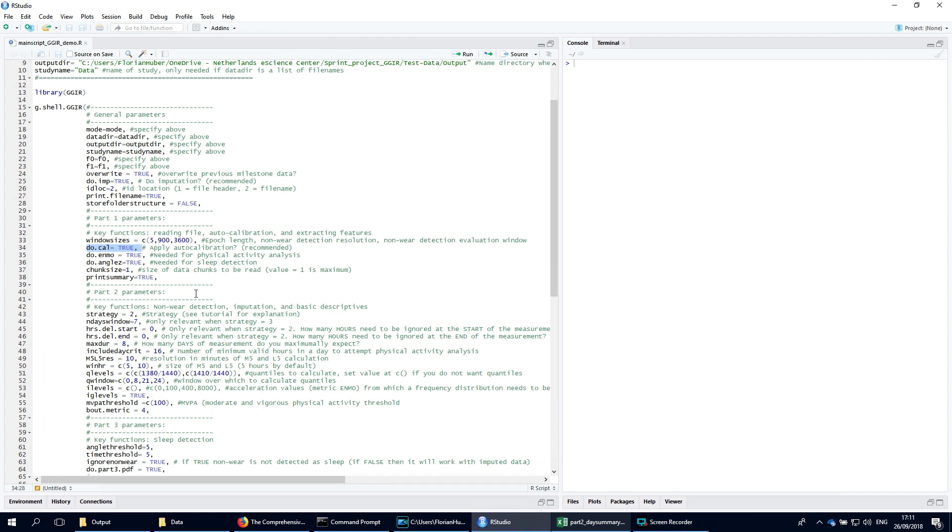The way the data is aggregated can be done with one or multiple metrics, which attempt to separate gravitational and movement related acceleration. In the background, the output of part 1 and the other parts are stored in milestone files. With argument override you can specify whether these milestone files need to be overwritten if they already exist, which helps to avoid doing double work.